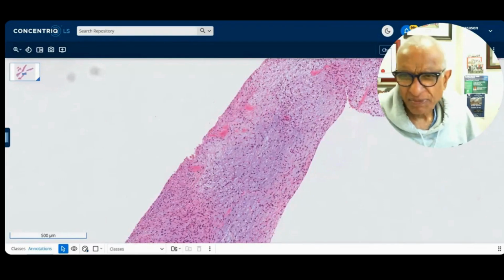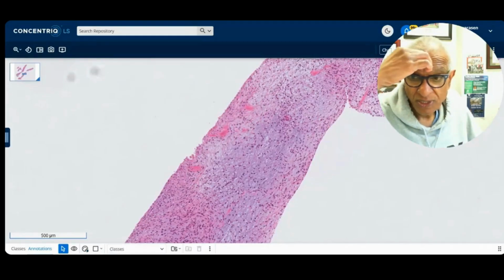Okay, we'll keep the myxohyaline background, Solomon. Variable, yes, they do. And there's no mitoses. I did not see any mitoses. So NR4A3 is negative. Myxofibrosarcoma low grade, that's very good. Sorry, there's two answers. Solomon, myxofibrosarcoma.